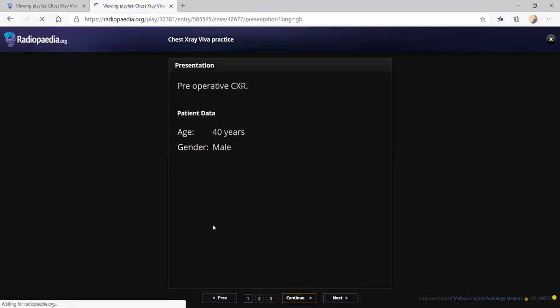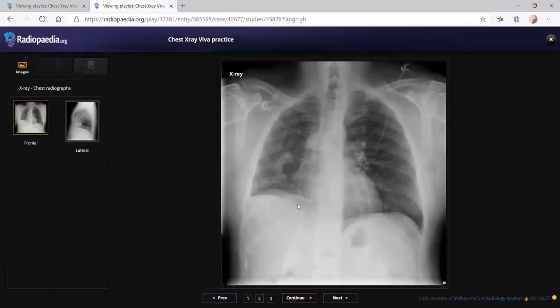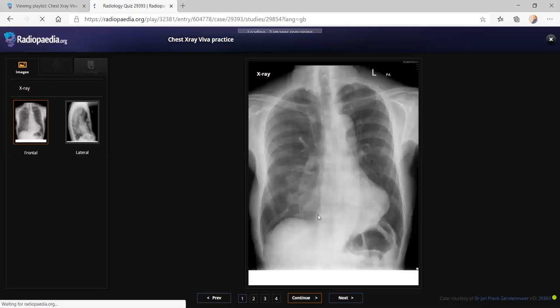It's usually seen in young males, usually 20-25 years old. It was a preoperative chest X-ray. As soon as you diagnose Scimitar syndrome, with the hypogenetic right lung and the hyperexpanded left lung, the volume will come down. So you have to tell all the findings: the right lung is relatively small, there is a scimitar-like vascular shadow in the right lower zone, and then tell the diagnosis. That's all. No discussion will happen.